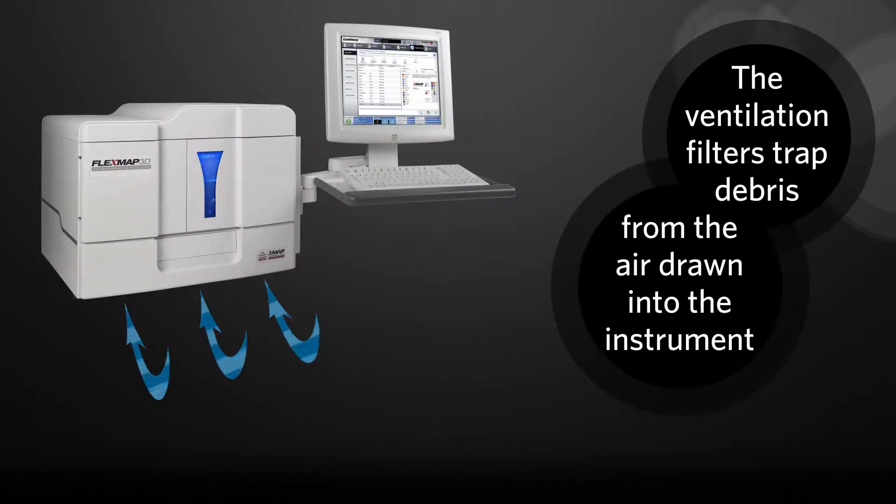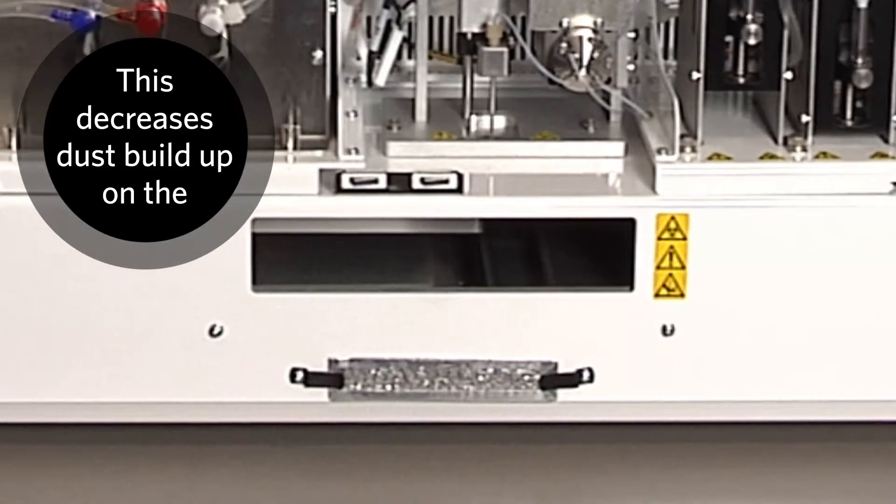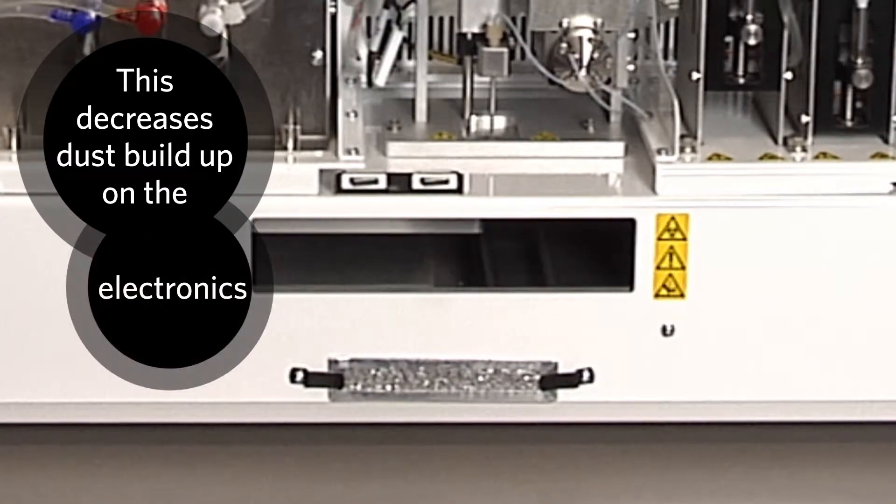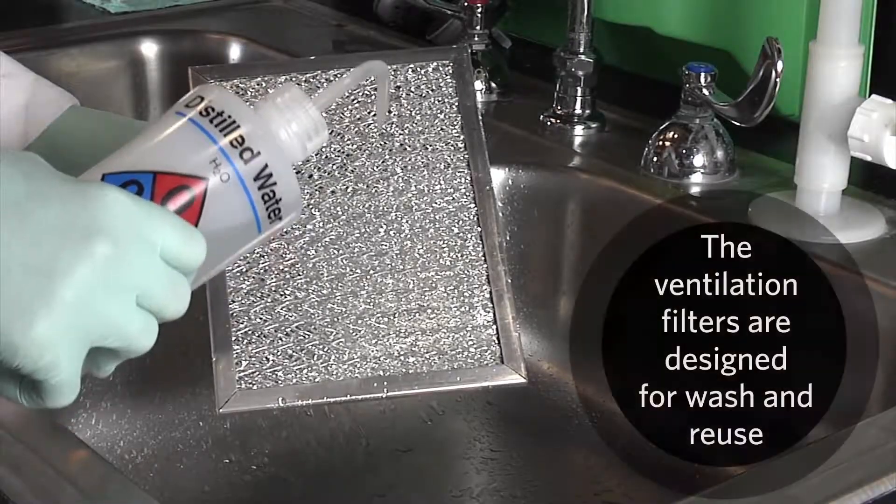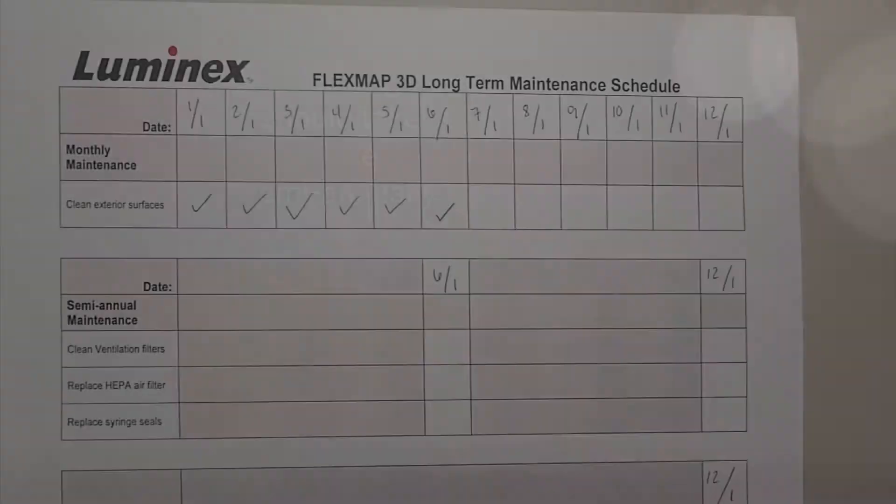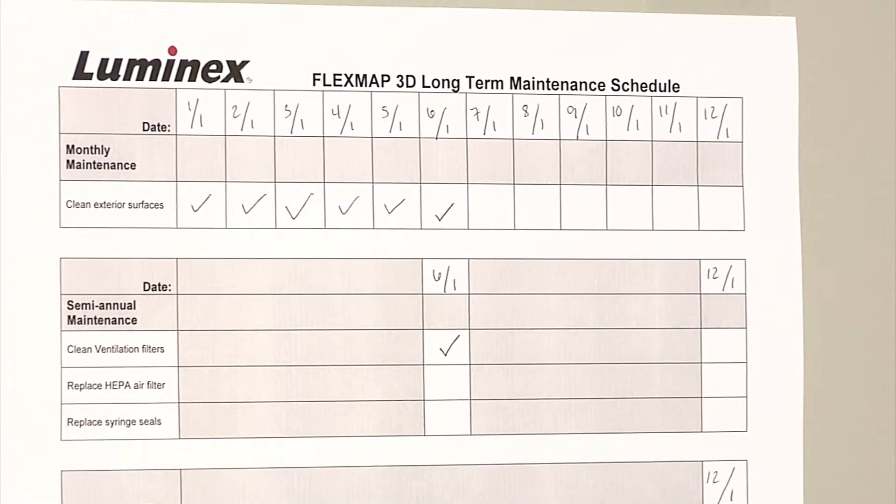Why should I clean the ventilation filters? The ventilation filters trap debris from the air drawn into the FlexMap 3D instrument. Cleaning the air pulled into the instrument decreases dust buildup on the electronics and the main bay where the sample probe is housed. The ventilation filters are designed for wash and reuse. Cleaning should take place semi-annually to prevent clogging of the airflow to the instrument.